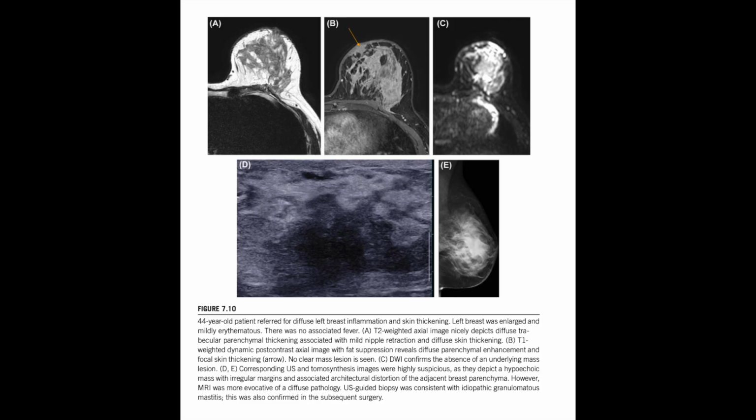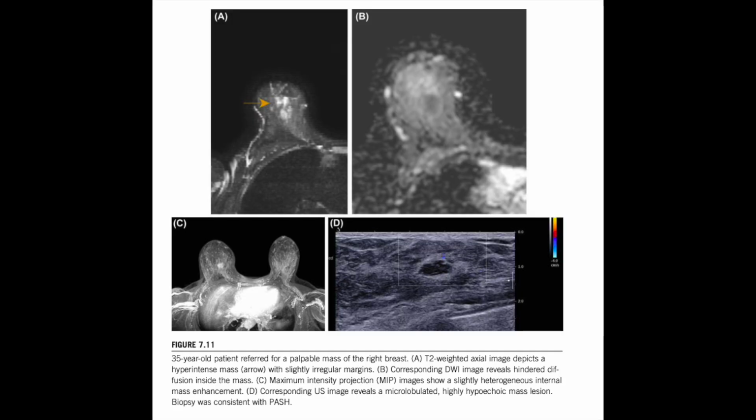that mimic being benign. Yes, and this is a critical diagnostic pitfall. The one everyone needs to know. It's called mucinous carcinoma. It's a subtype of cancer that is commonly mistaken for a totally benign fibroadenoma. How? It presents as a round or oval mass with perfectly circumscribed margins, and critically, it shows gradual or persistent enhancement. So, type 1 or 2 kinetics, the safe kinetics. This safe kinetics, it looks soft, it looks round, it acts slow, but it's cancer.